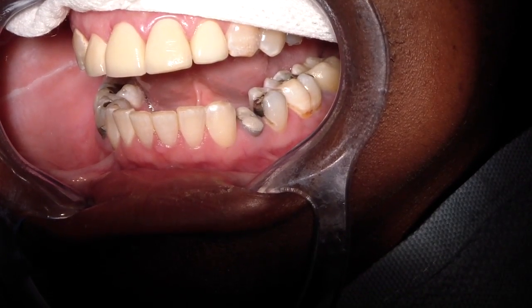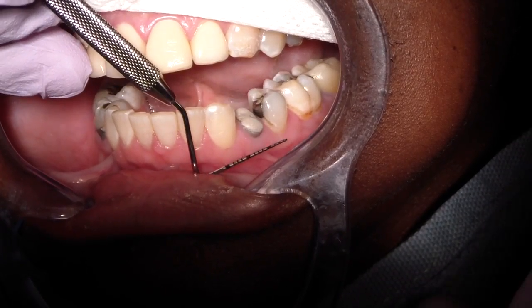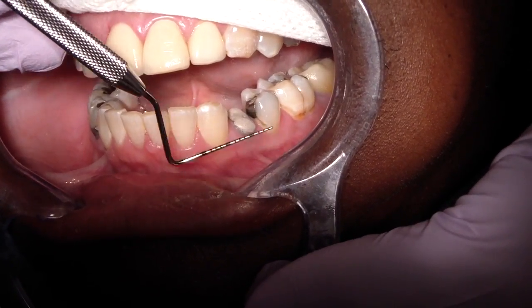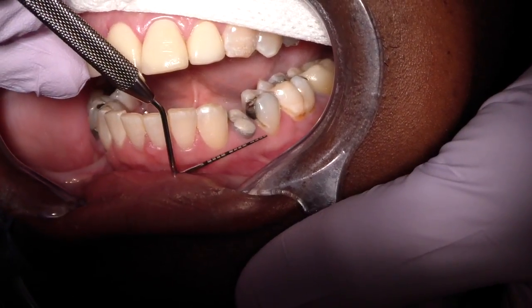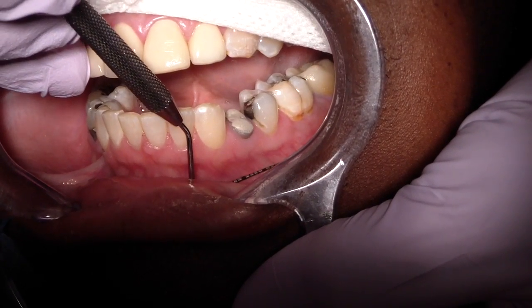Hey, this is Ashley at History.com. We're just about to perform a crown lengthening surgery. One of the things I was thinking about was the techniques I've been shown — there are a number of them, but a couple of easy techniques to determine how much attached gingiva you have. One of them is called the roll technique.